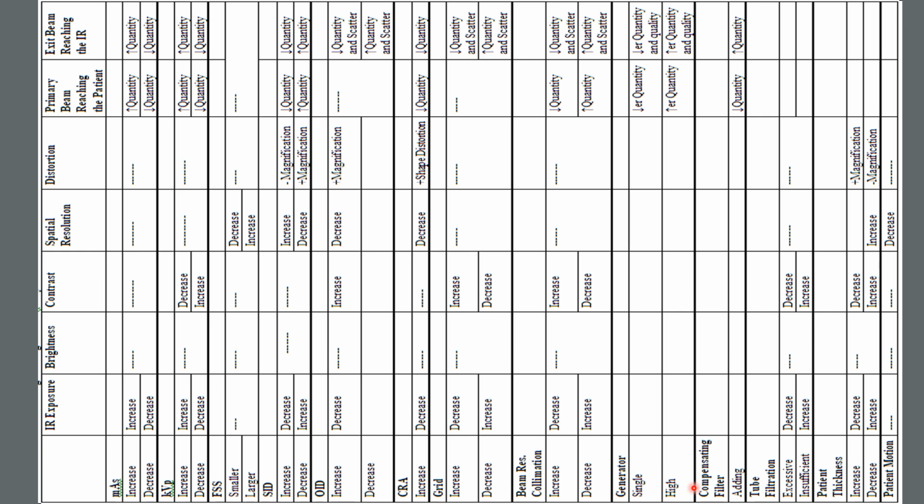Also, work on becoming good at setting your own technique. So when you're in a situation where you need to set a fixed technique, you can do it correctly the first time. I often set my own techniques even in the room, and exposure-wise, I know that the image is going to come out good.